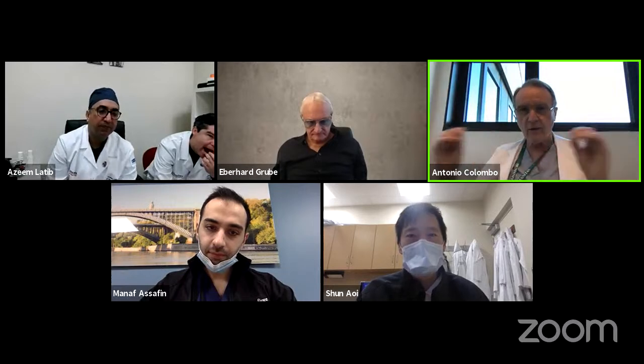I have the perception that you do not need to stent long and go from healthy to healthy and cover any dissection, and that you can use pressure gradients or something to evaluate if the dissection needs to be treated. But we need to generate data because we cannot go by our feeling.